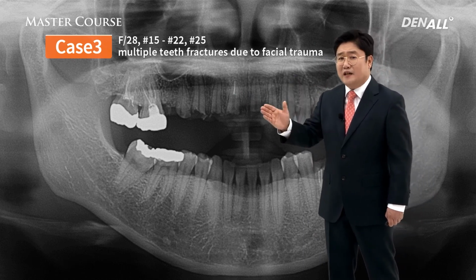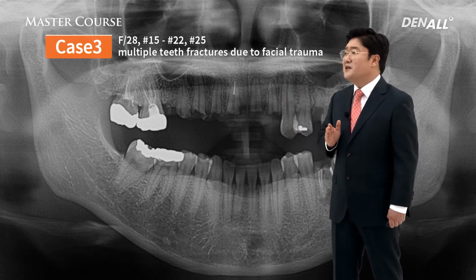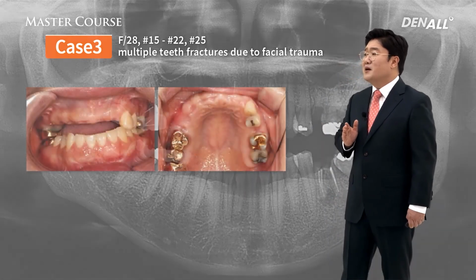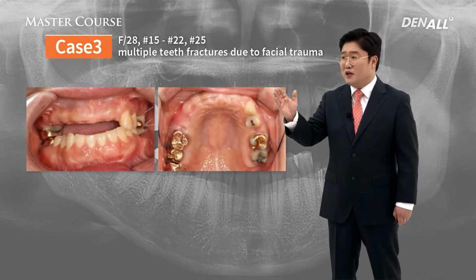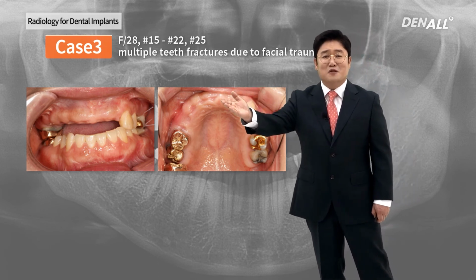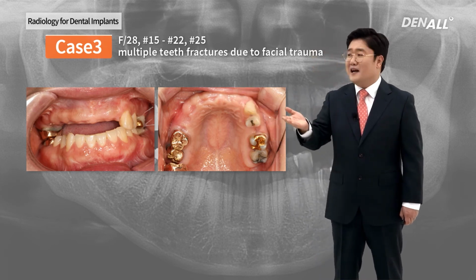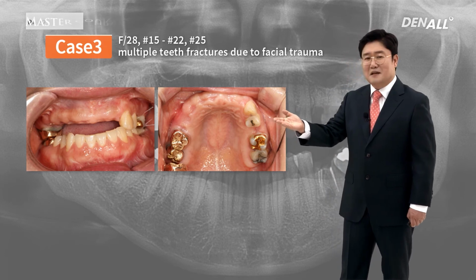The positions of the implant and their relations need to be identified. Therefore, what we did was, this is pre-op. How terrible it is. The trauma is very terrible. This is a young patient. All front teeth are destroyed. She must have suffered tremendously.